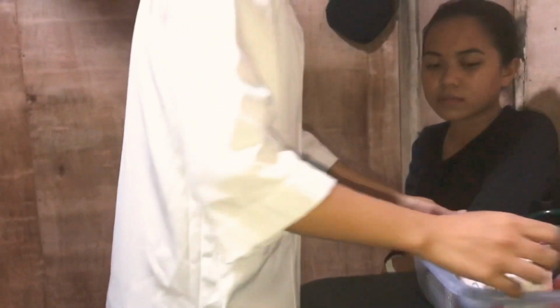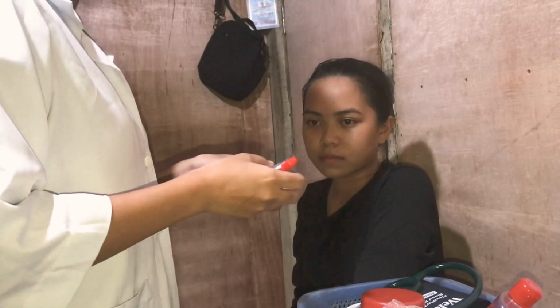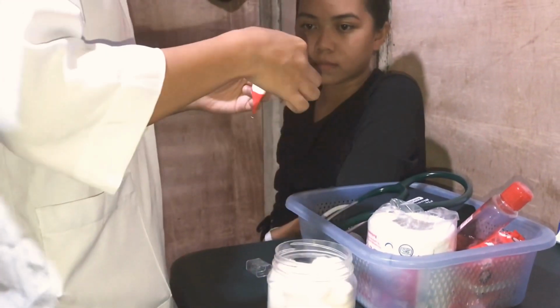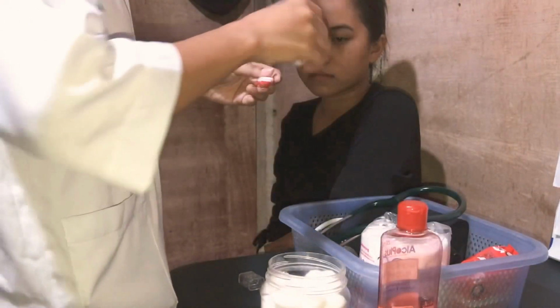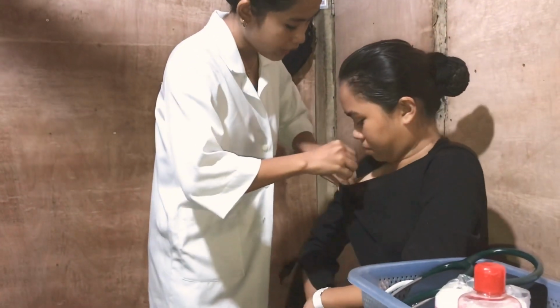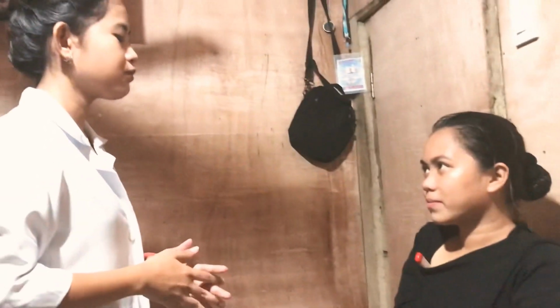And now, ma'am, I'm going to take your body temperature. And first of all, provide hygiene to avoid spreading of microorganisms. Now, we will wait for the exact amount of time. And while waiting for your body temperature, ma'am, I will take your apical pulse.